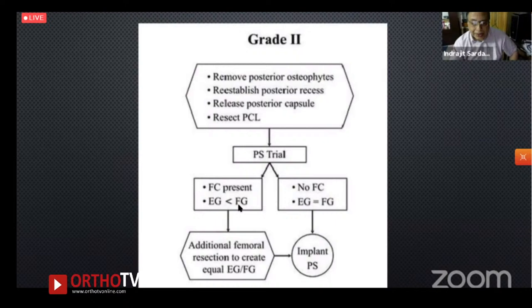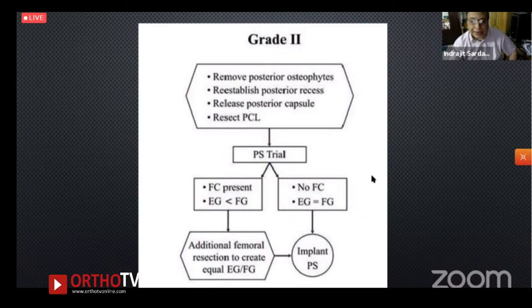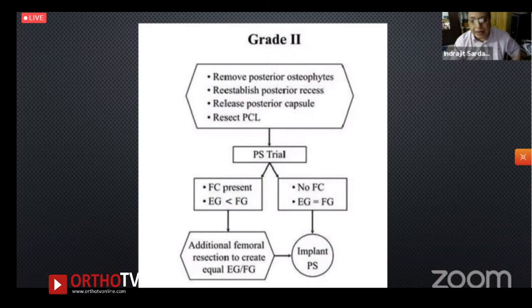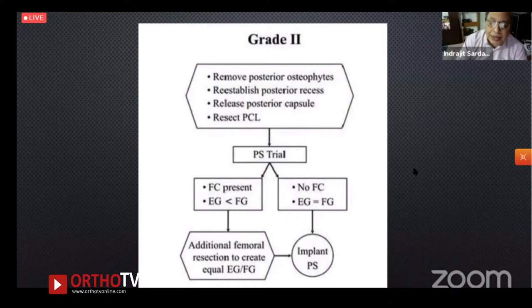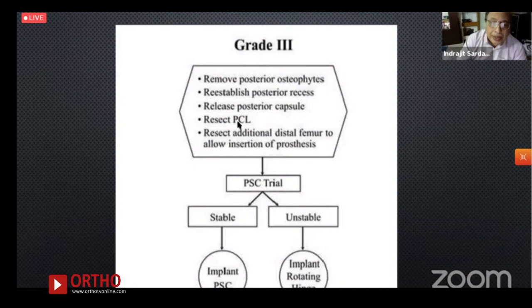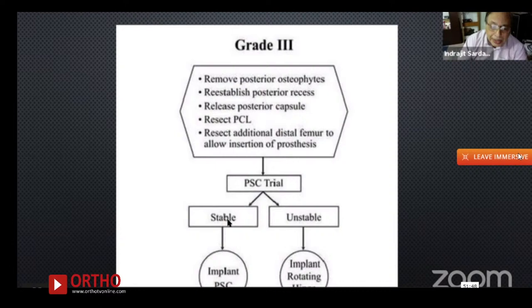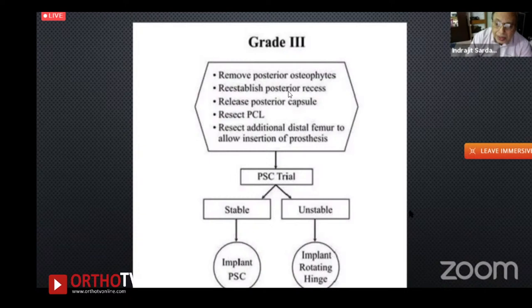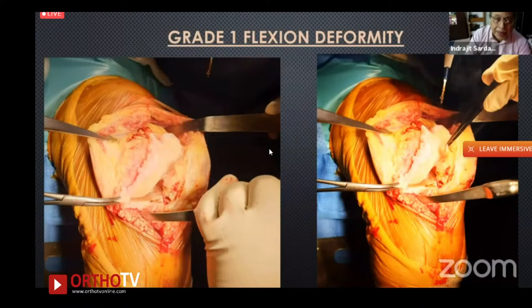For Grade 3: in addition to all the above steps, additional distal femoral resection is performed. A trial is done; if stable, proceed to implant. If still unstable, consider a rotating hinge — which should be available on the table but is not always required. A video then demonstrates the posterior capsule release using a curved osteotome to go all the way around the back, followed by thorough clearance of posterior osteophytes.